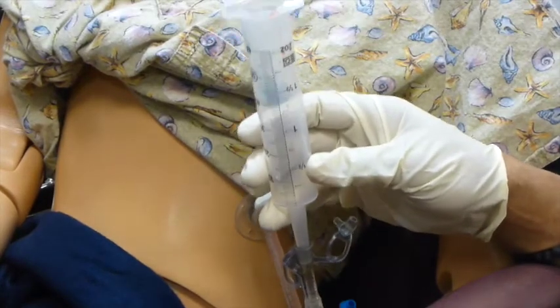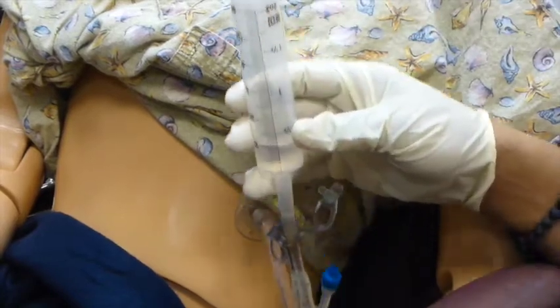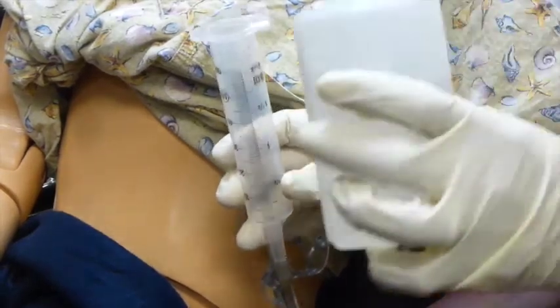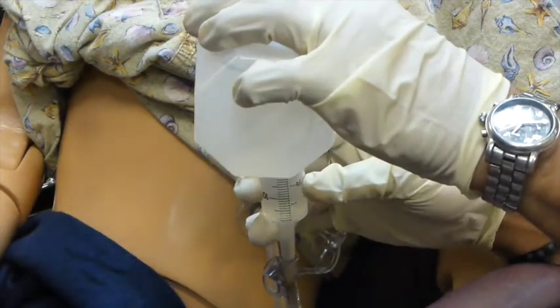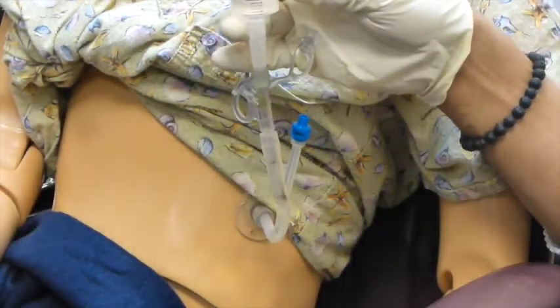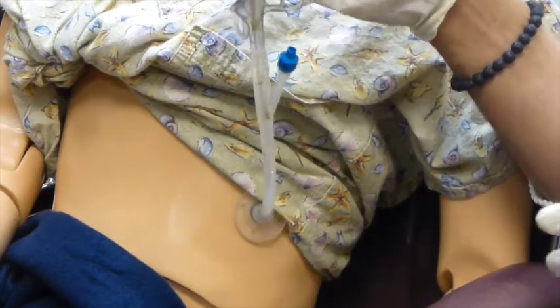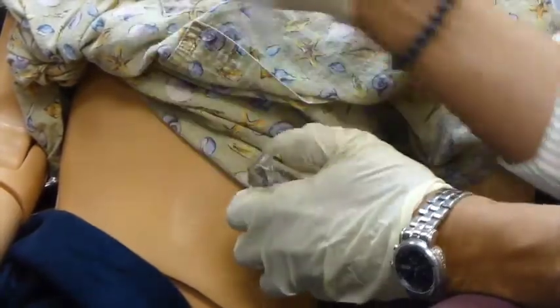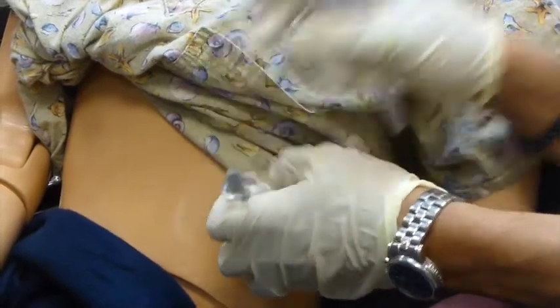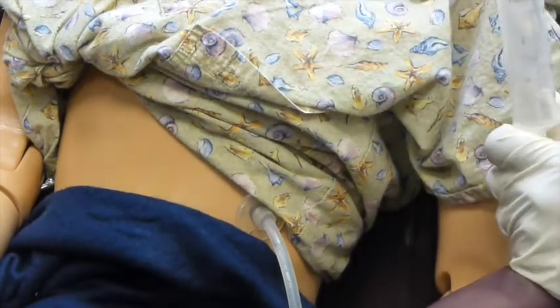Now I am putting the last medication in. Then I finalize with the 30 cc's as the doctor prescribed. Clamp it — it's in. Unclamp, then clamp it back. 'Your meds are all done. Have a nice day.'